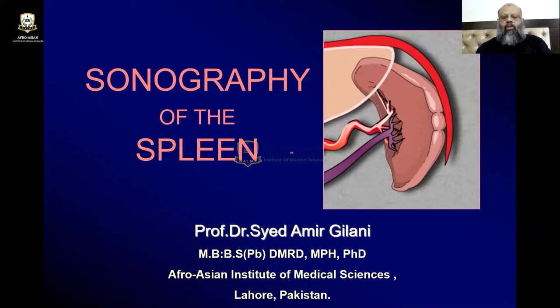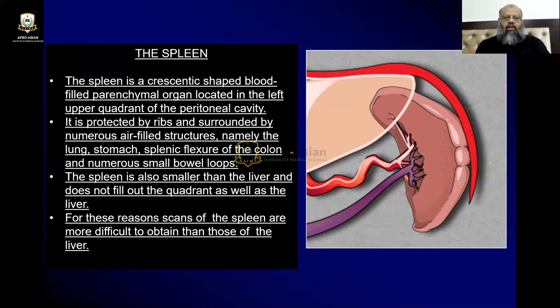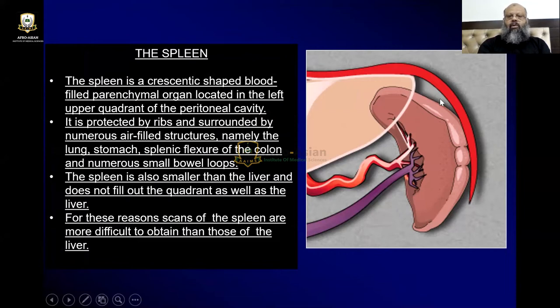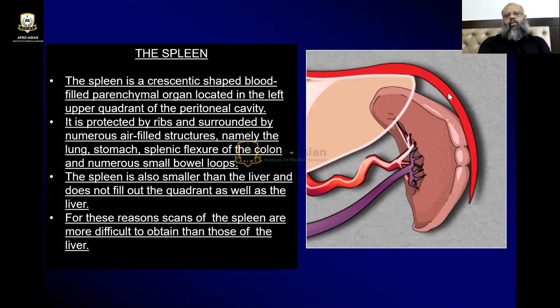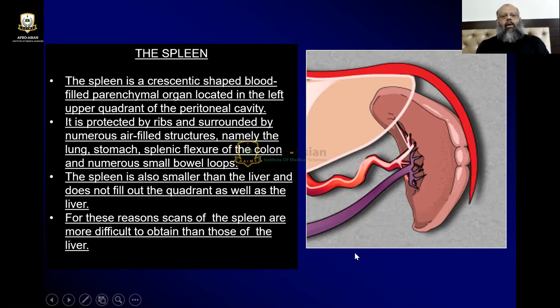Sonography of the spleen. The spleen is a crescentic-shaped, blood-filled parenchymal organ located in the left upper quadrant of the peritoneal cavity. You can see the diaphragm, the left lobe of liver, and then the spleen. It is protected by the ribs and surrounded by numerous air-filled structures, namely the lungs, stomach, splenic flexure of the colon, and numerous small bowel loops — all these structures are covering it.